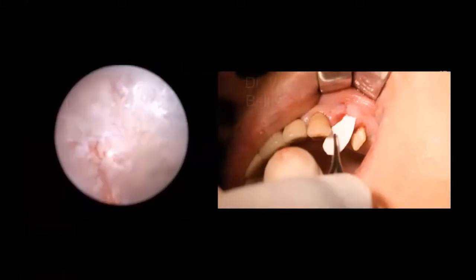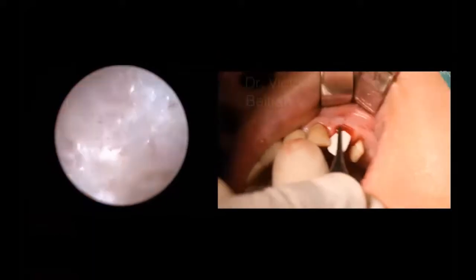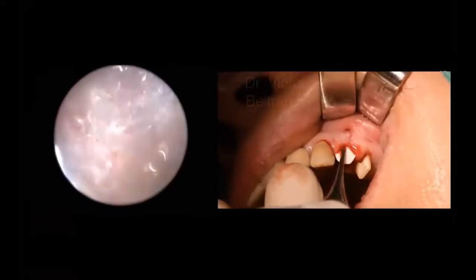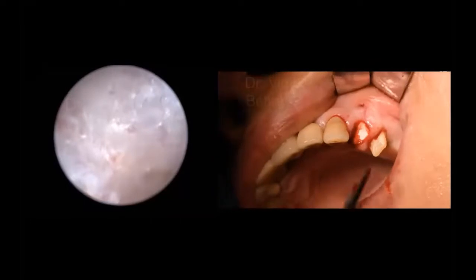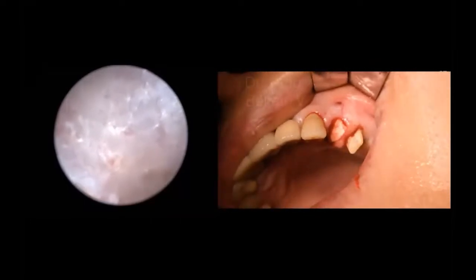Here, I perform a last examination through the endoscope to visualize the integrity of the buccal wall, and it's possible to appreciate a small fracture feature, but without compromising the periosteum. Then I place a preconformed collagen membrane through the tunnel, and I seal the occlusal portion of the alveolus above with a biomaterial, in this case, a particulate allograft, before the placement of the final suture.